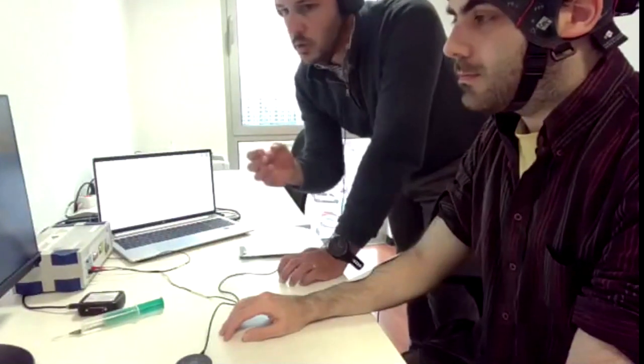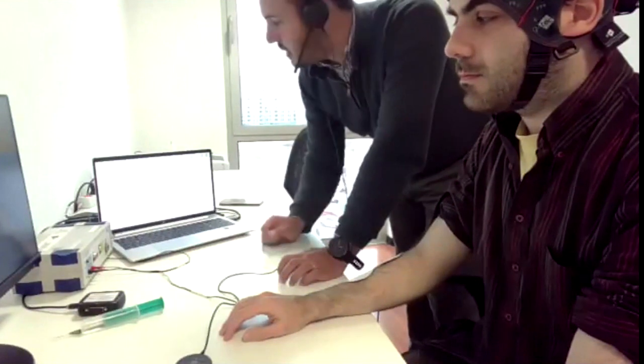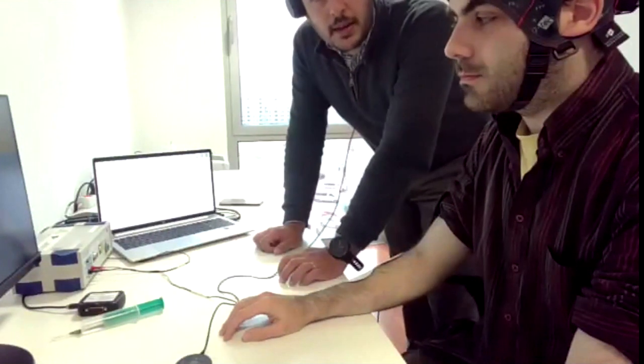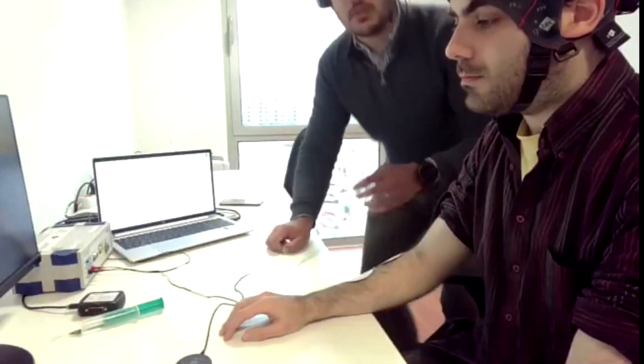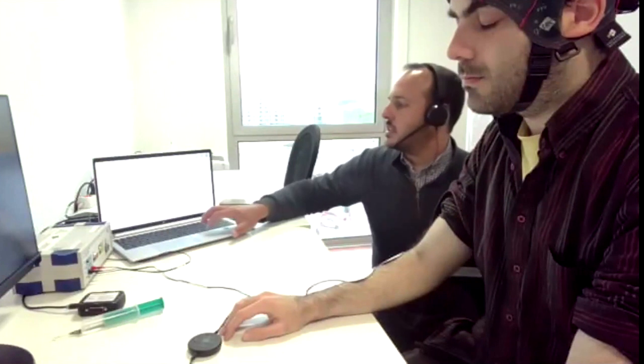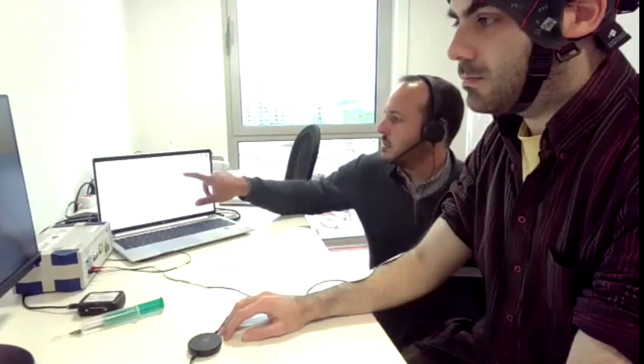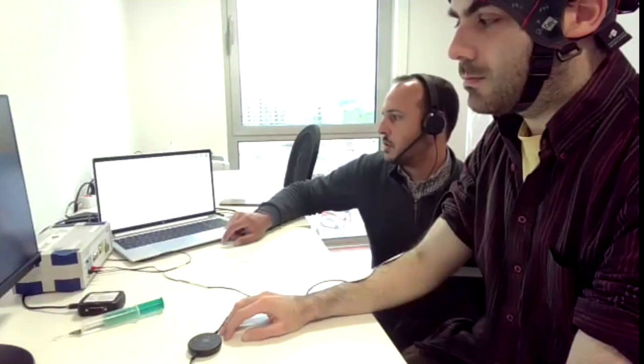If we want to really check that the signals that we are getting are EEG, we can do two tests. The first one is to ask the patient to close his eyes, and we can see in the EEG how the alpha waves appear. The second thing that we can ask him is to move his mouth, and then we can see these artifacts on the screen.